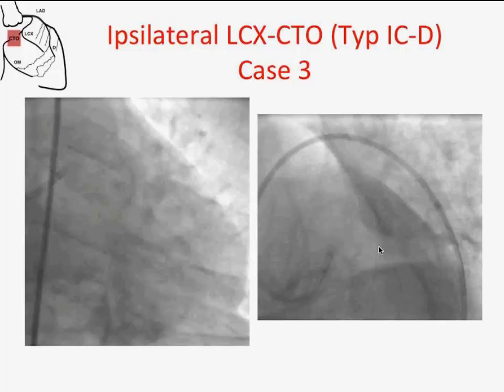So I'm always thinking about the patient. Two punctures are not a problem, we know it, if we're experienced operators, but if you can avoid it and do it with one puncture, I think it's no problem. You have to know the limitations, but sure. Also in the first live case, I had an 8 French Launcher, and you can bring in 8 French an IVUS and 2 microcatheters, 2 Corsairs.